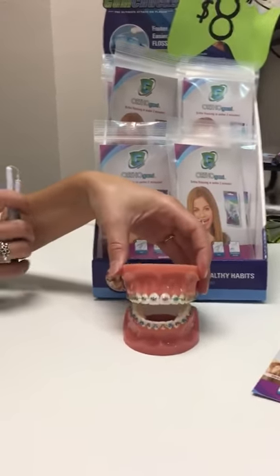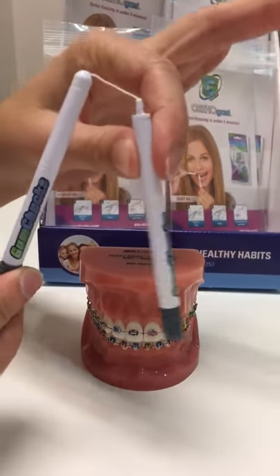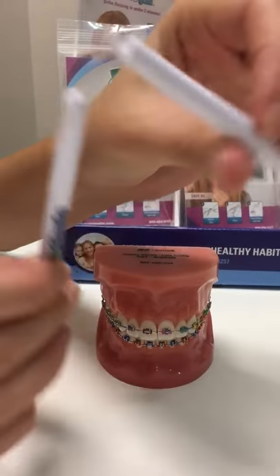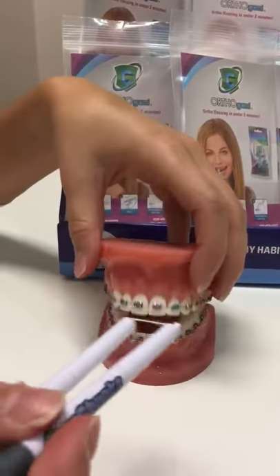Today we are going to go over how to use gum chucks. They look like nunchucks and they're awesome for braces or without braces. These ones have a little hook on the end, which is great for getting under the wires.